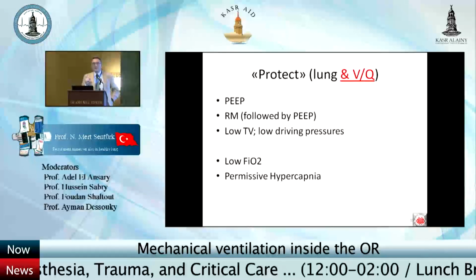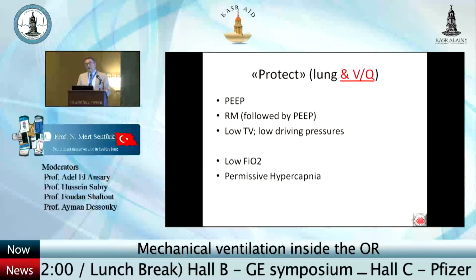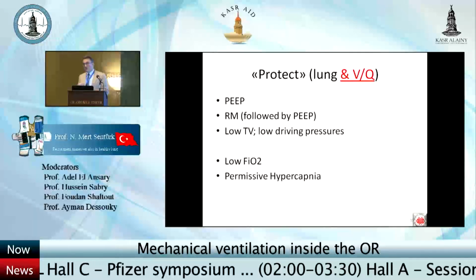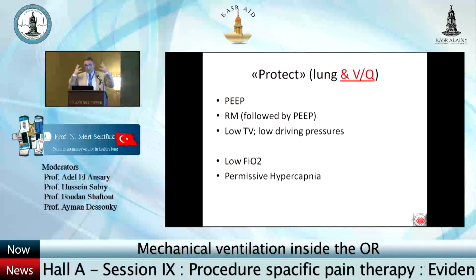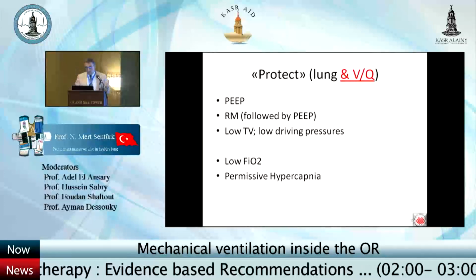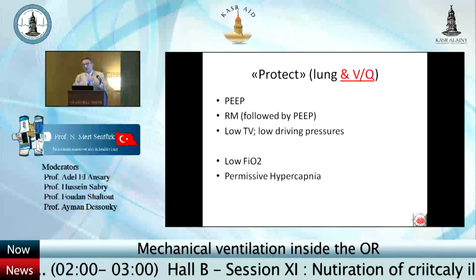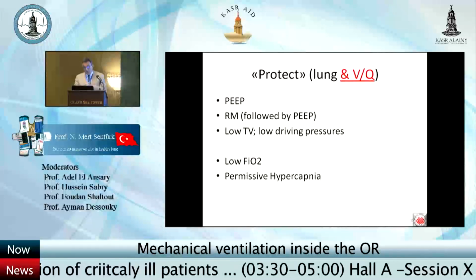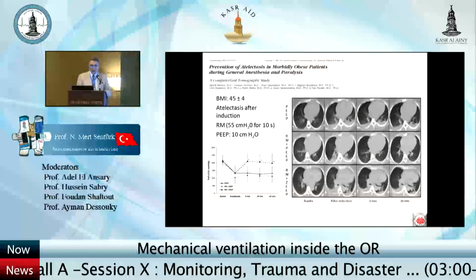But the recruitment maneuver can also have some complications. If I scream very often, this would harm people in the front seats too, especially if you have some hearing problems. These screams can disturb your hearing, so I have to be very careful. The analogy holds for air bullae as well: if you have bullae in your lungs, the recruitment maneuver can cause a pneumothorax or other complications.